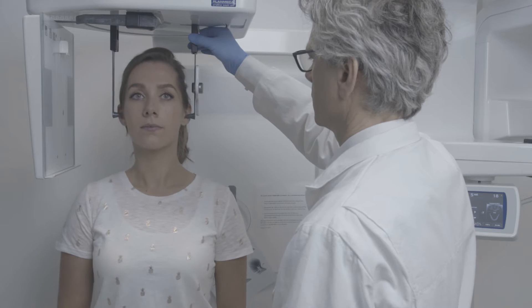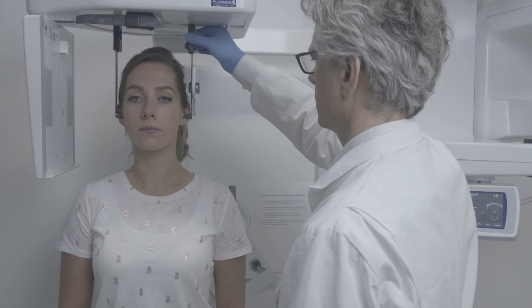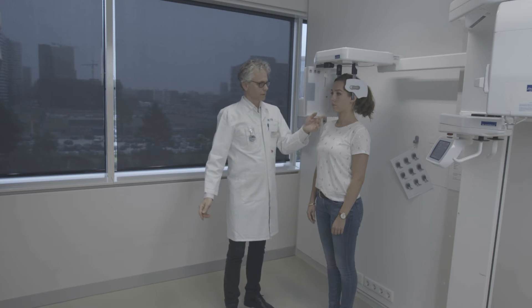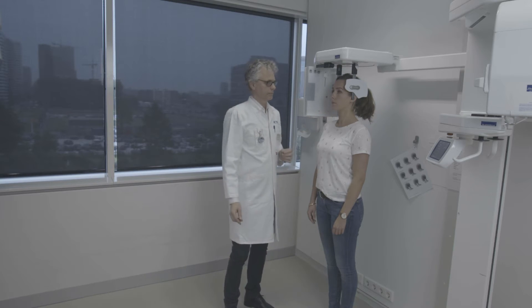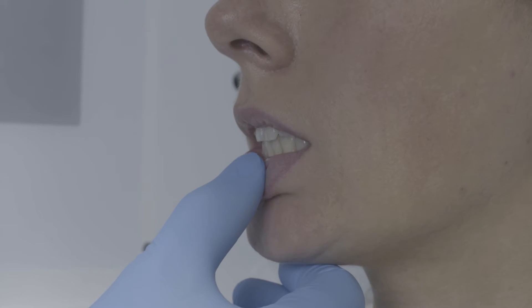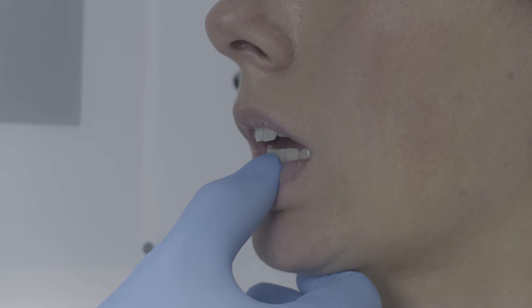The earplugs are brought into the auditory canals. The head of the patient is guided into the correct horizontal position. Now we check the correct occlusion of the patient and we ensure a relaxed lip posture.